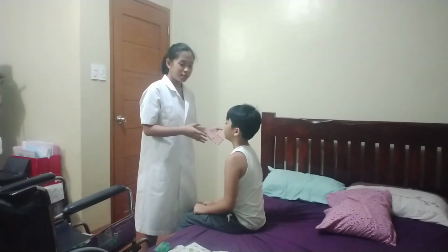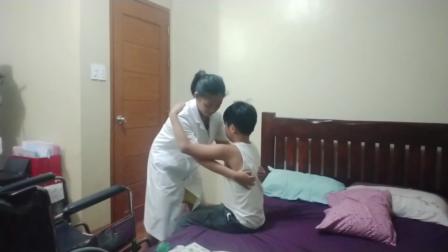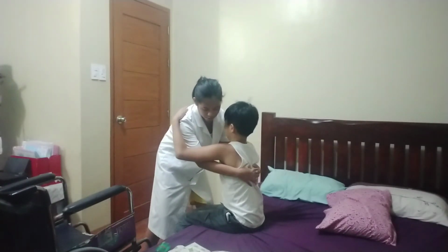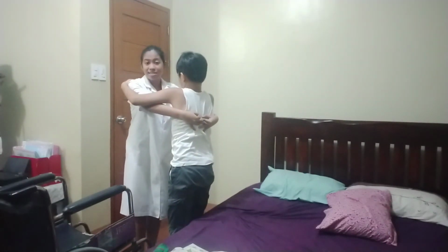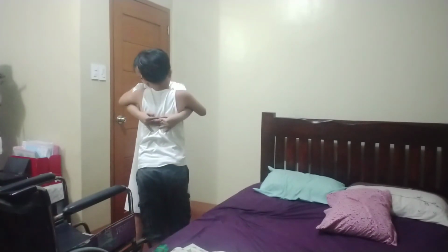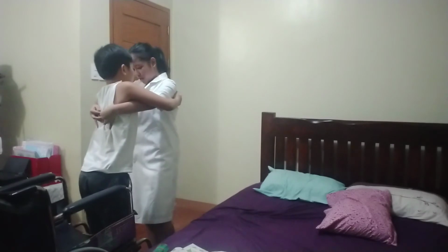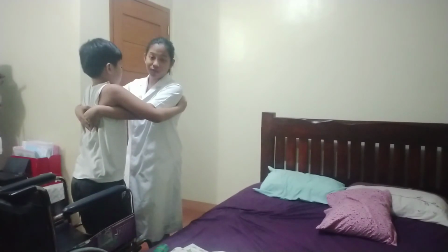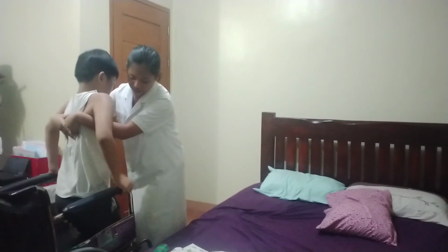So I will now proceed to lifting my patient. Okay, hawak ko kayo, sir. Okay. 1, 2, 3. Iangat ko na po kayo, sir. Okay, sir. And then I will pivot on my back leg and assist the patient in turning until the patient can feel the wheelchair against his leg. Then I will ask the patient to use an arm to steady himself on the arm of the wheelchair. Okay, sir, use your arm to move.